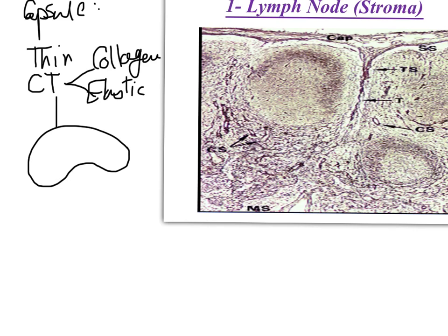It is penetrated by the afferent lymph vessels, bringing the lymph for its filtration. So this is for the capsule.